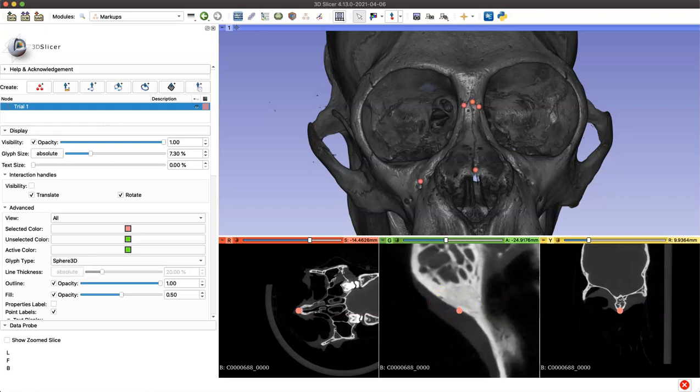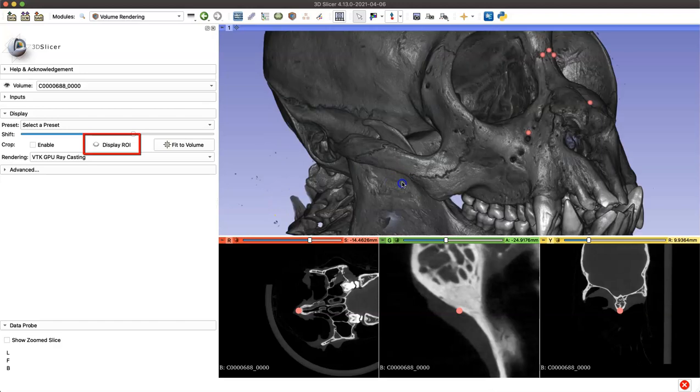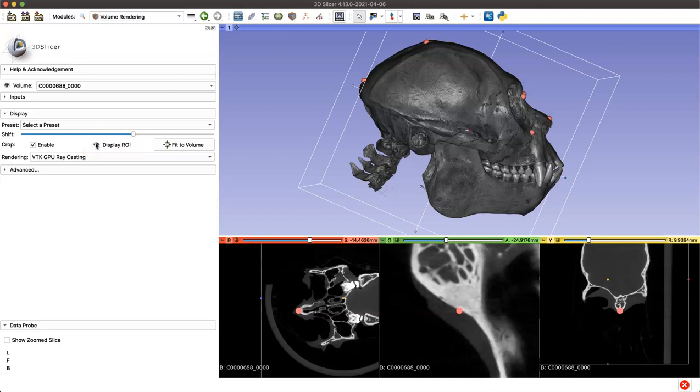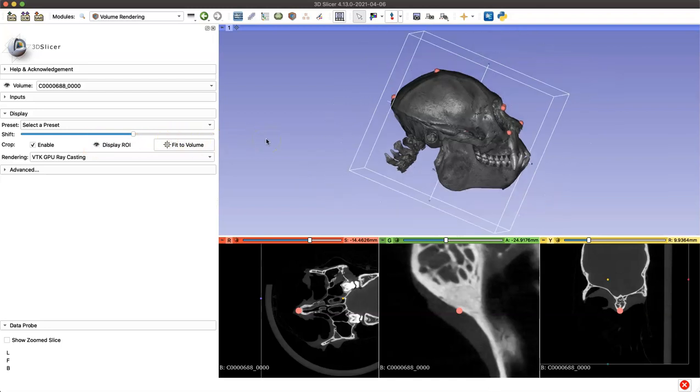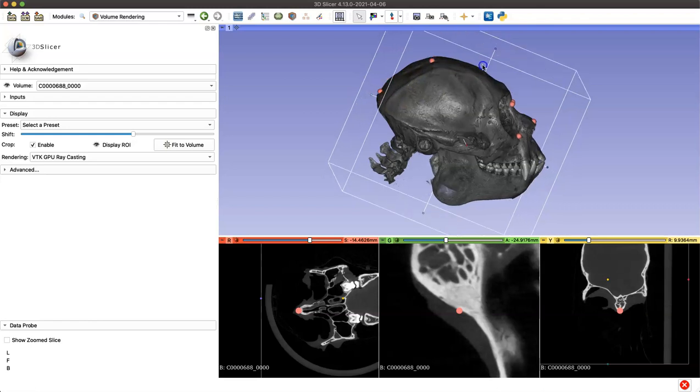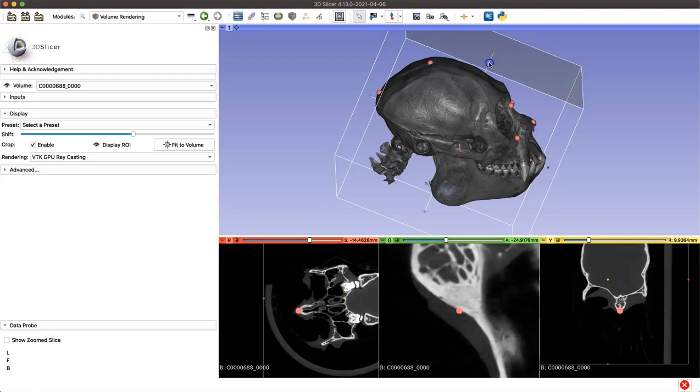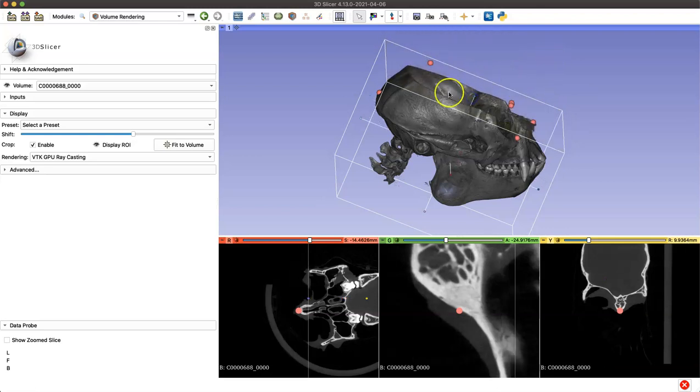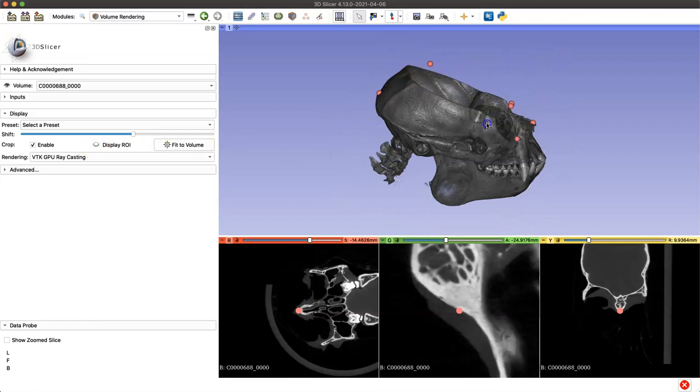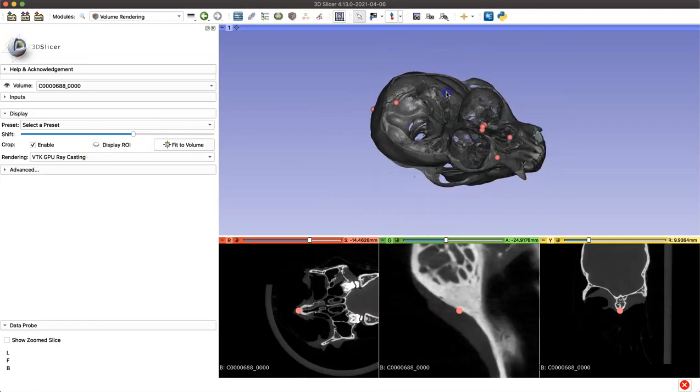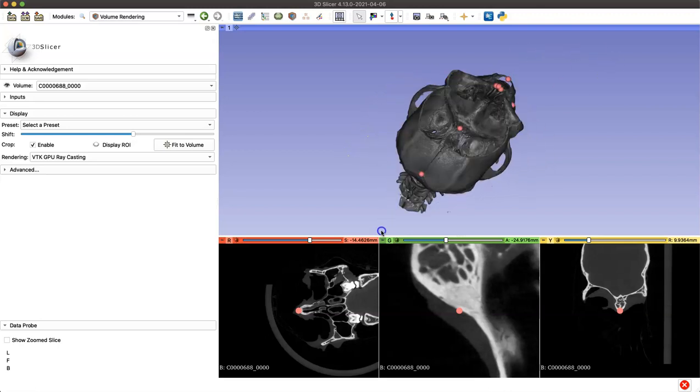The second tip is for when you're collecting landmarks inside a skull. We're going to navigate to our volume rendering module and toggle on the visibility of our region of interest by clicking this display ROI button. On each side of this cube there's a small colored sphere that when you click and drag it's going to take away part of your volume on that side of the cube. This can be really helpful for taking endocranial landmarks because as you can see when I turn our model, I now have access to the inside of the skull and can place landmarks in there as well.